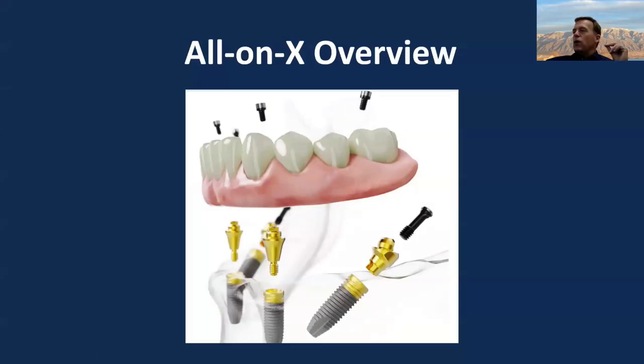So what I'm going to go over on X just really briefly. Interestingly, this is that gold anodized thing I was telling you about that is designed to create better tissue attachment to the abutment and hopefully create better implant health.